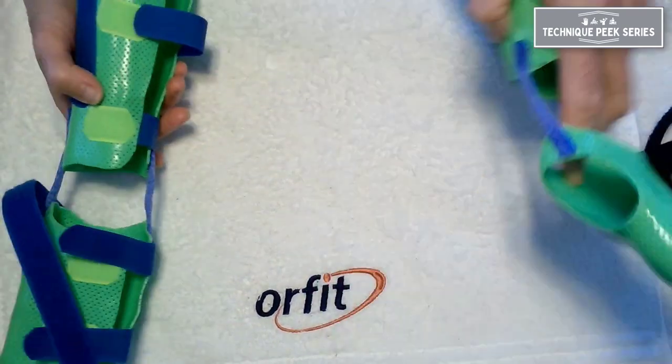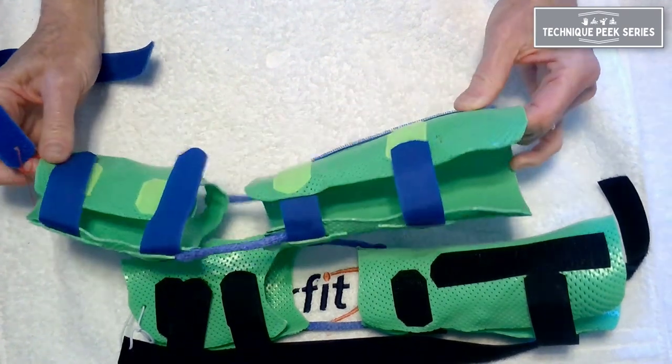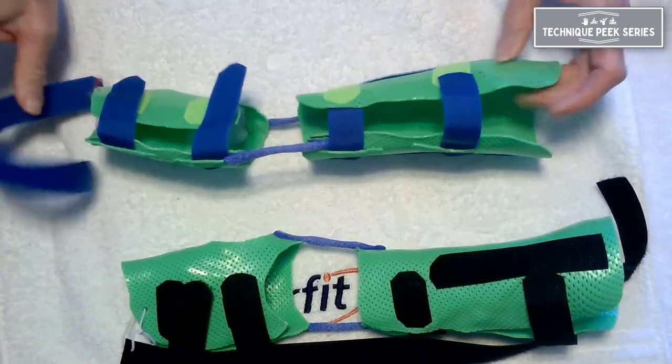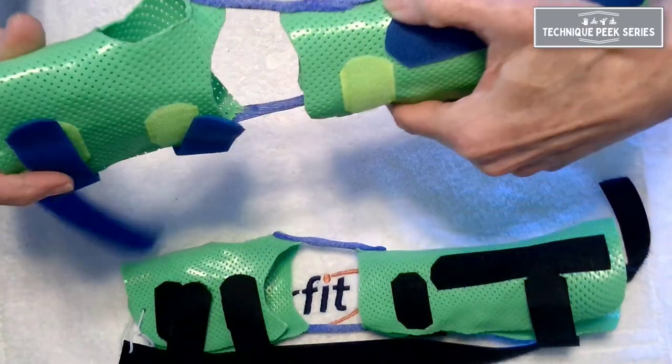This is a simple design — low profile and lightweight. I've used a 1/12th-inch thick material to make my circumferential base, and then just connected rolled OrphiCast as my hinges.